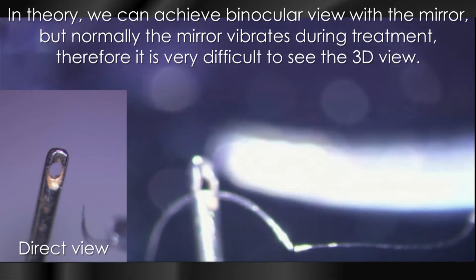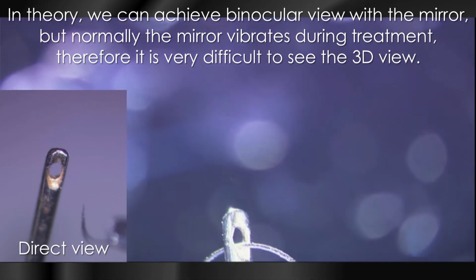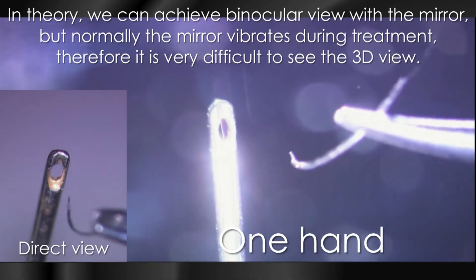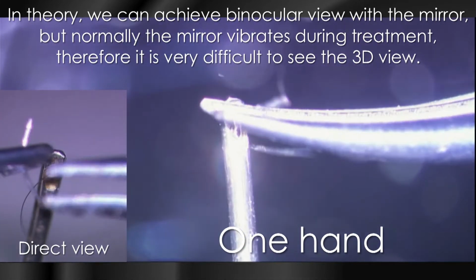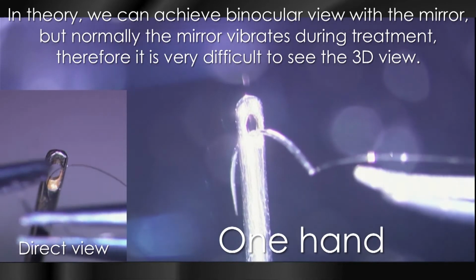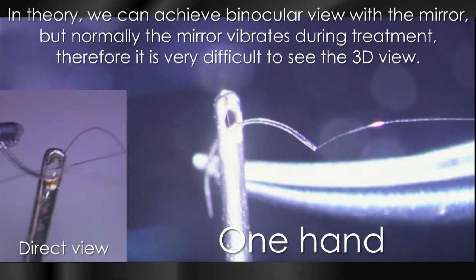And the mirror technique is one-hand treatment, very difficult to pass the thread. So left side is direct view. Please watch, comparing direct view and mirror technique.